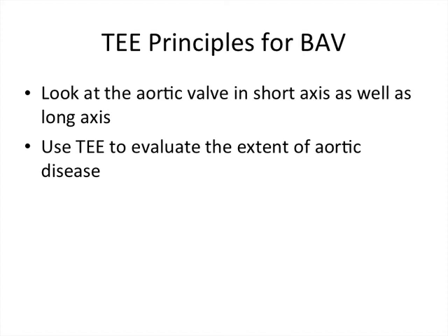The surgical procedure for this patient included an aortic valve replacement with a 21 mm tissue valve and replacement of the ascending aorta with a HemoShield graft. The postoperative TEE images will be seen next.